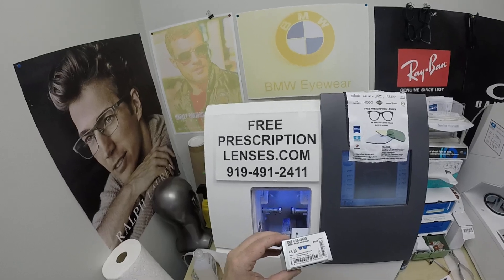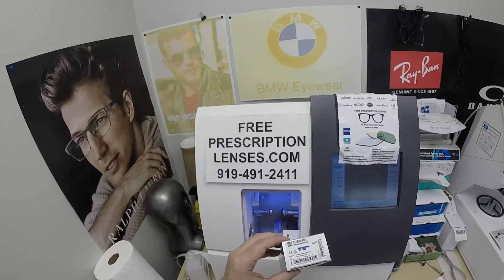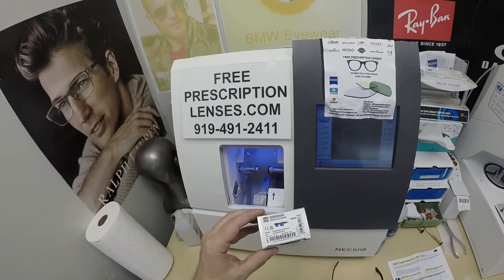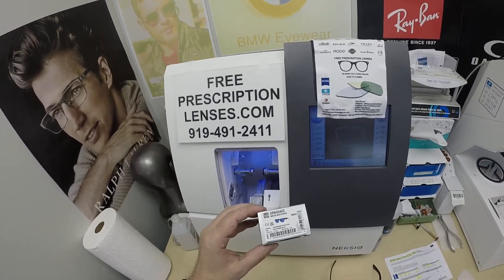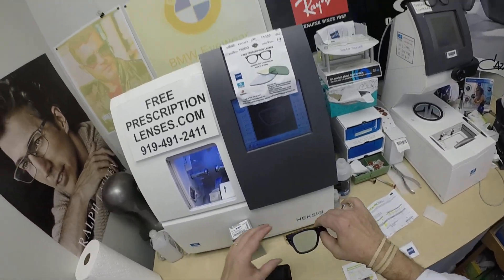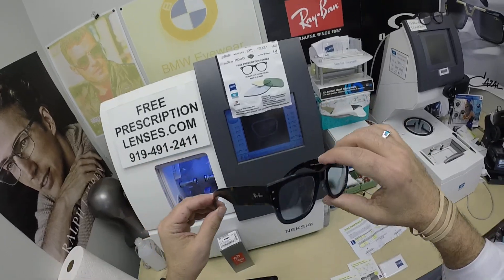Now it comes in one size, which happens to be the 51 size. It comes in several colors and ranges in price from about $174 to $199 depending on color. He got color 6638, which has the blue front and the tortoise temples.